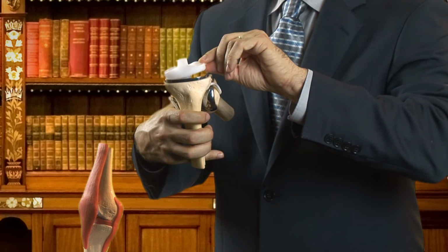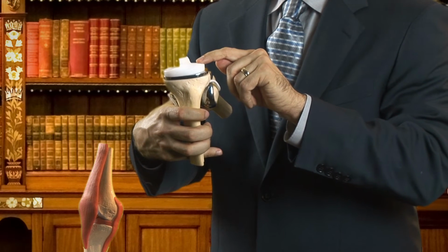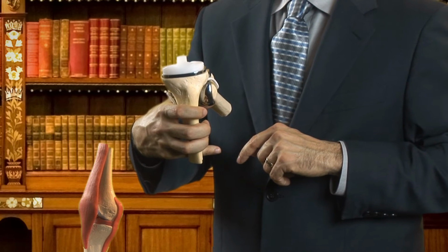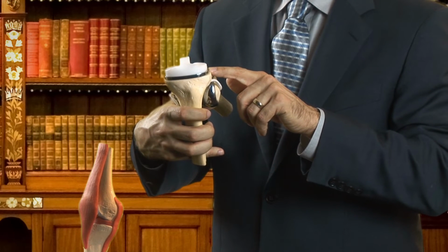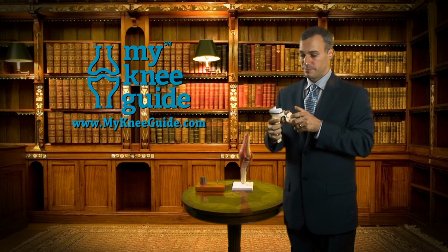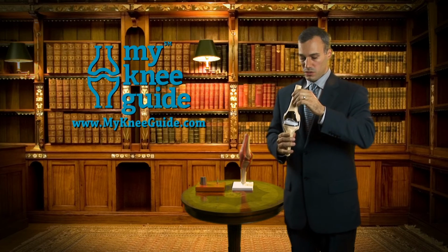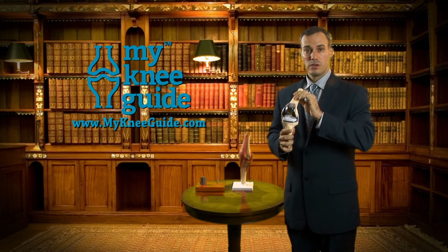When you apply it, you can see that this allows a little bit of spin on top of the tibial base plate. The more traditional polyethylene is called a fixed bearing. In the fixed bearing polyethylene, this plastic will actually be snapped into the underlying tibial tray. So let's bring the two edges of the bone together. You can see that we've created a very nice, normal hinge joint with good flexion and extension.